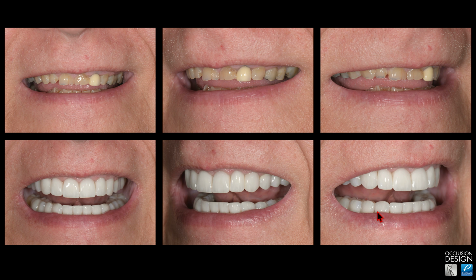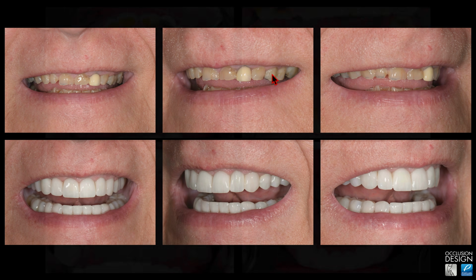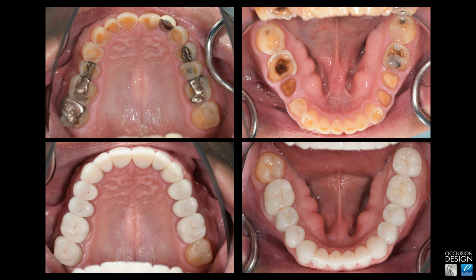He did pick a pretty white shade, which I don't blame him. It looks a little bright here because of the flash; in person it's not quite this bright. It's quite nice. But if you have teeth that are pretty yellow, A3, A4, you typically want a fairly white smile.